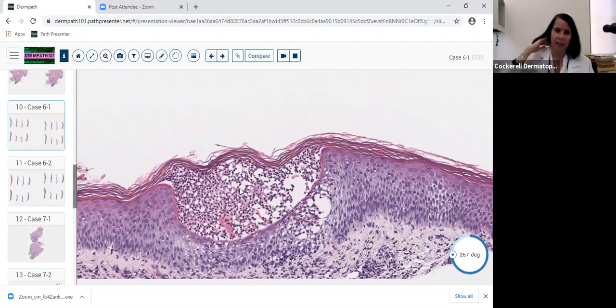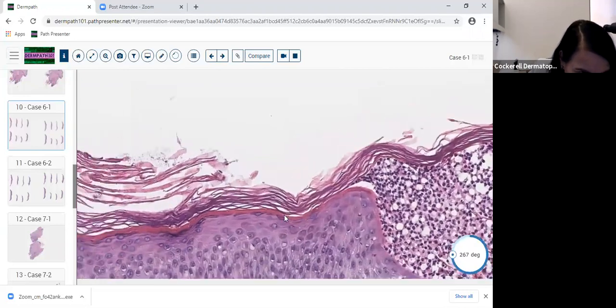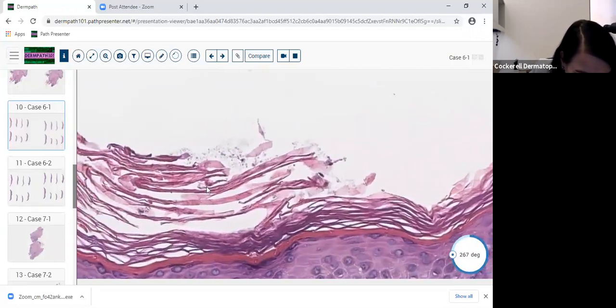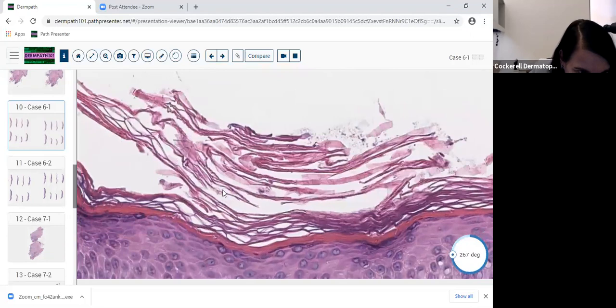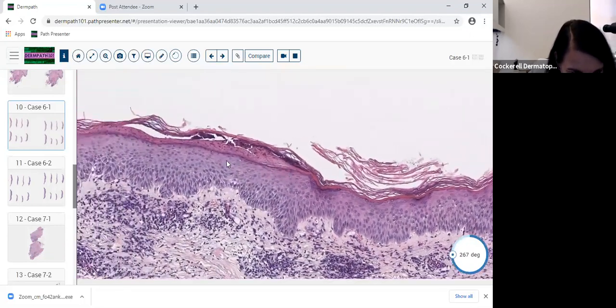And it could be. But when you see neutrophils in the stratum corneum, think infection. Could this be superficial fungal? Also think about the possibility of an impetiginized process. So I want to look at my stratum corneum very closely. I'm seeing some trash up here. Those bacteria, no, those don't look like cocci. Looks like debris. And I'm looking around and saying, wait a minute, is this a sandwich sign here?